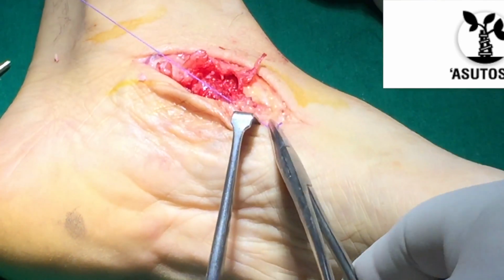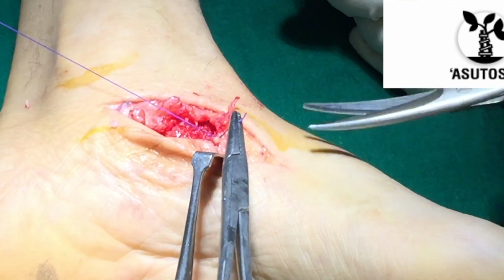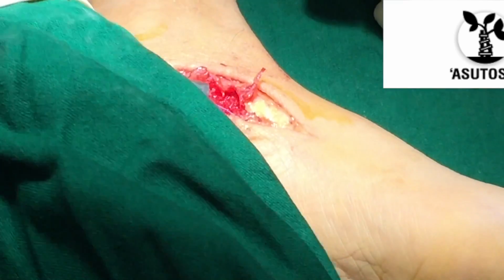And then we would be closing the skin in a subcuticular manner.